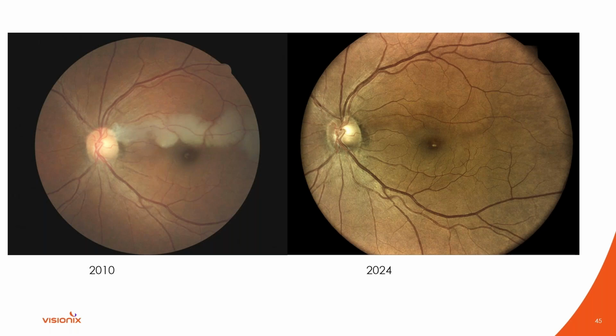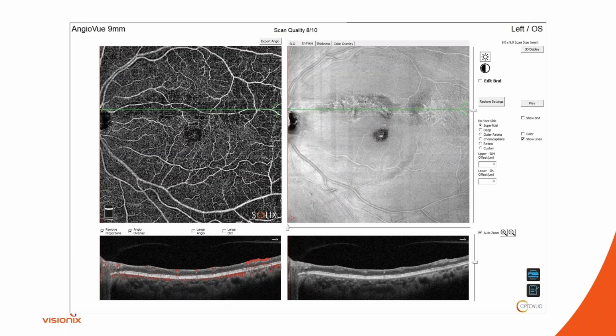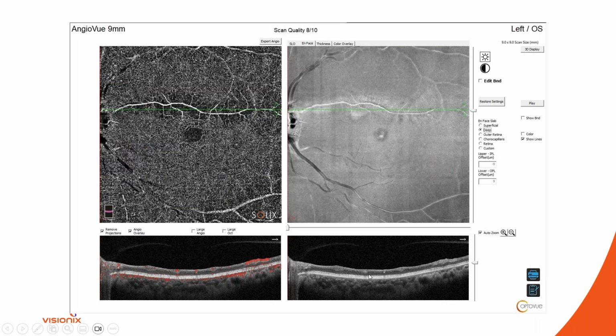But here's the question: do these patients ever recover? Does this patient have good function in that area? So I just wanted to share with you because I thought it was really cool. We got an OCT-Angiography over the area, and you can see here that, yeah, clinically he might look better, but he still is lacking a lot of blood flow within that segmental area of the artery occlusion. And you can also appreciate how atrophic the retina got. It almost is like half the size of a normal retina.